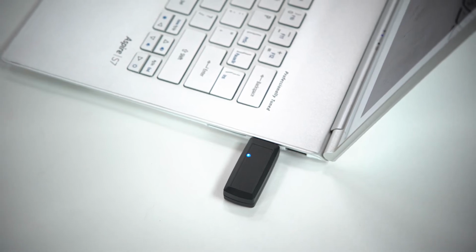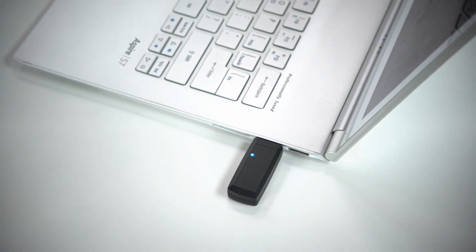The power light on the dongle indicates its current state. A green light tells you power is on, but the headset is not in range or cannot be located. A purple light indicates the dongle is searching for the headset. A blue light indicates the headset has been found, and a flashing blue light tells you when data is transmitting.